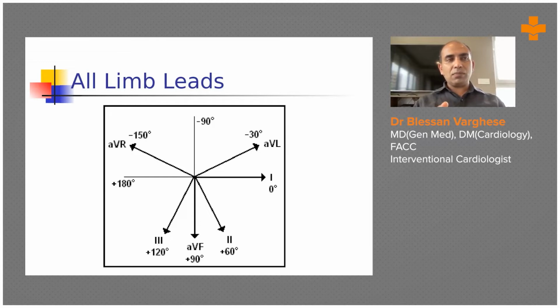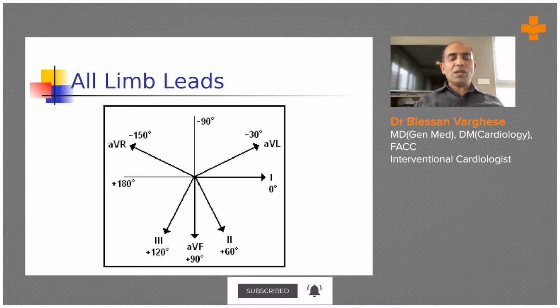This is the same x and y axis reference which we use in mathematics. On the x-axis, what we measure is the time, and on the y-axis you see the voltages. That's how the ECG is designed. The leads are placed with the heart at the center of a volume conductor. The heart is placed in the center, and you place the electrodes in different places in a triangle. If you can remember this axis, it's well and good. Even if you don't want to go into all the complicated axis systems, it's well and good.